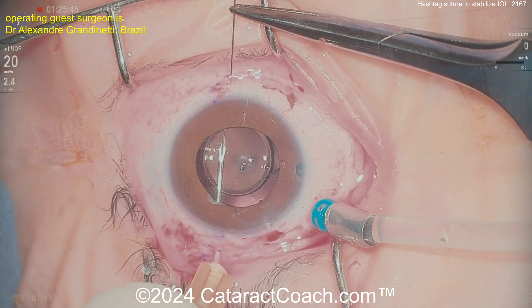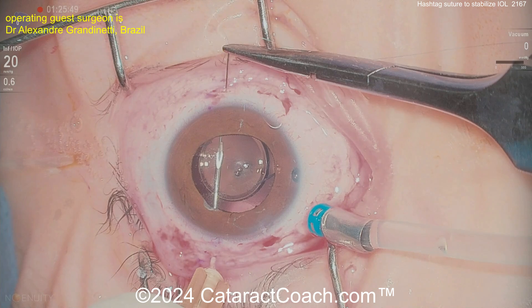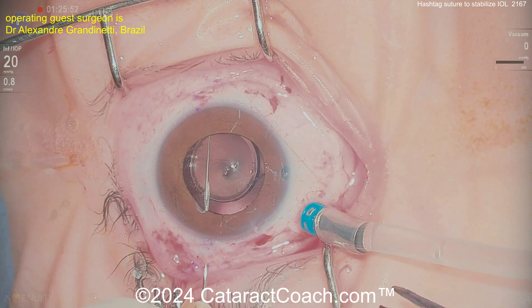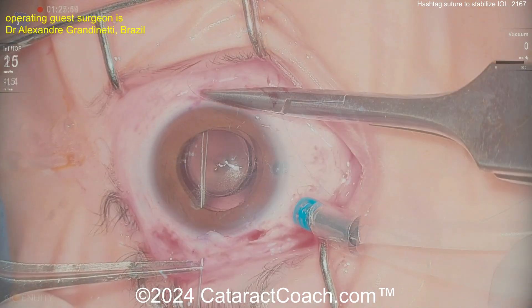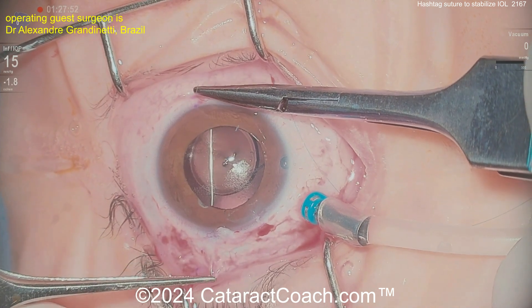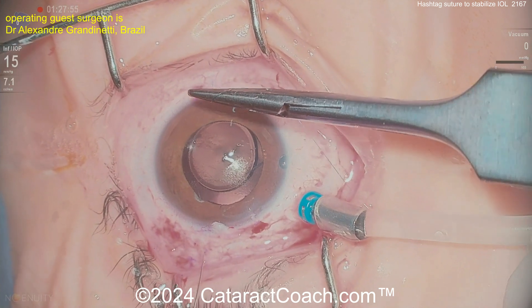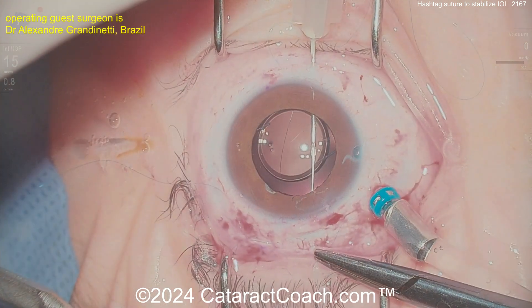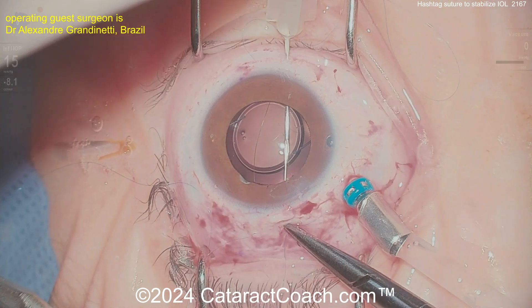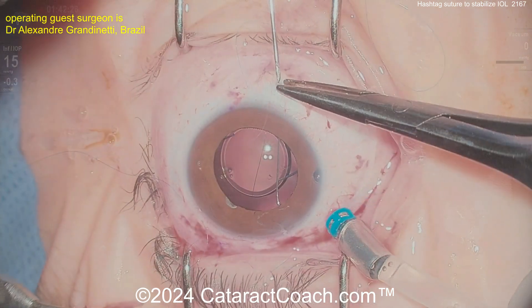Is there a way I can put in a hashtag suture? This is a 10-0 nylon suture — very small, maybe 10-0 polypropylene even. Passing this suture here, pulling it out — going to make basically a hashtag. Now you've seen a video before of the Masket basket, named by Sam Masket, which is placing similar types of sutures under the IOL optic so that during manipulations of the eye he uses a temporary suture to make sure things don't fall south, and then at the end of the case he removes it.